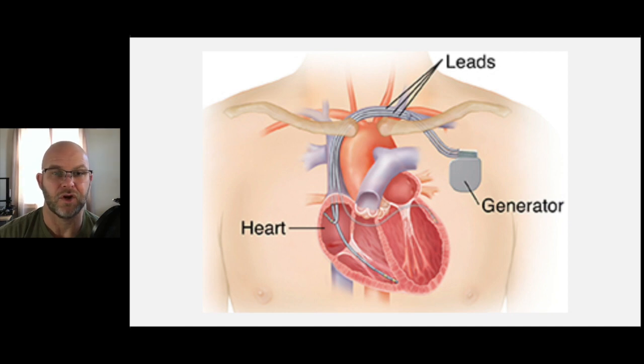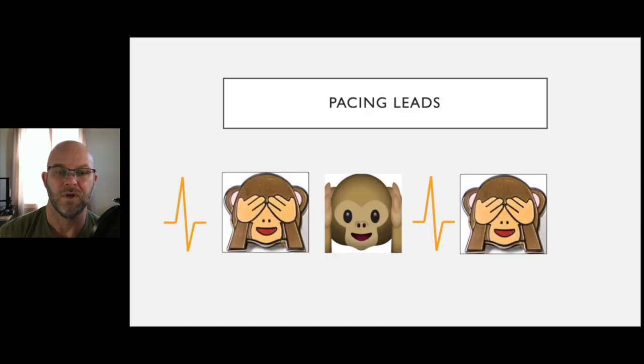If you need the cardiac resynchronization therapy, they'll snake it through the coronary sinus around the back of the heart. Now, all a pacemaker wants to do is pace. So all the parameters you put in there are actually telling it when not to pace. So it will pace, and it actually has a blanking period put in there where it will shut its eyes so it can't respond to anything. And then it will watch again and reset a timer.